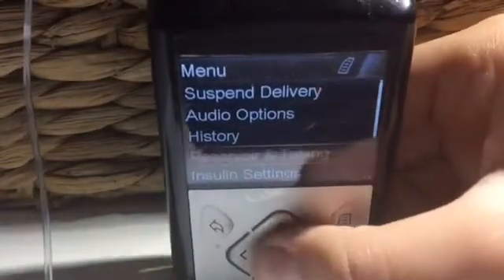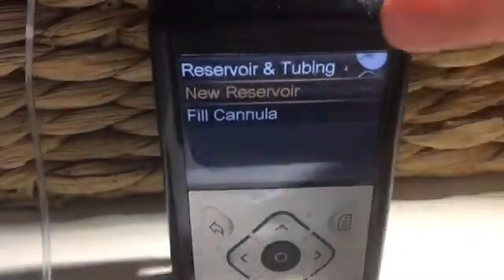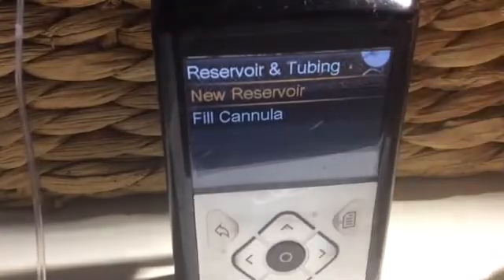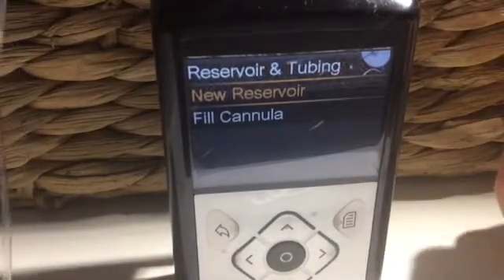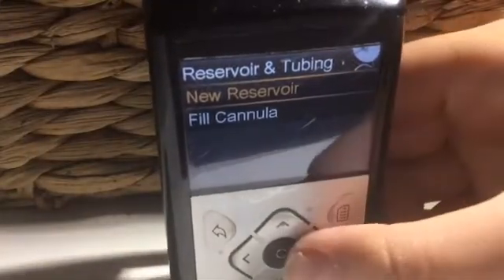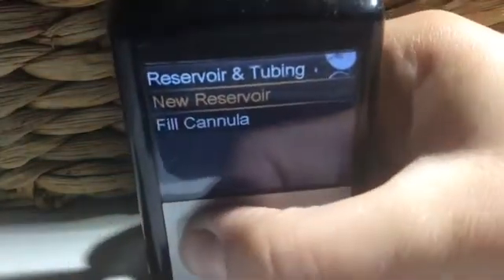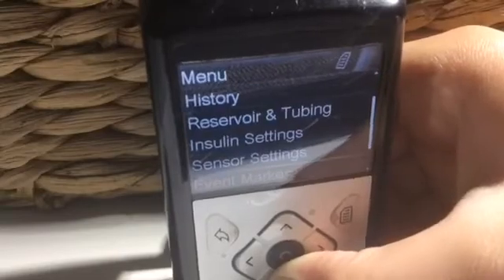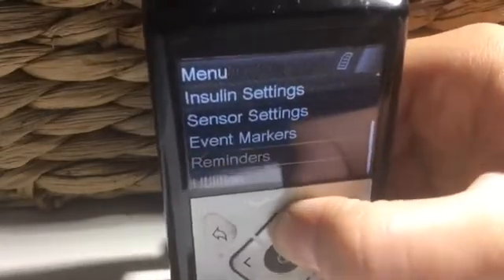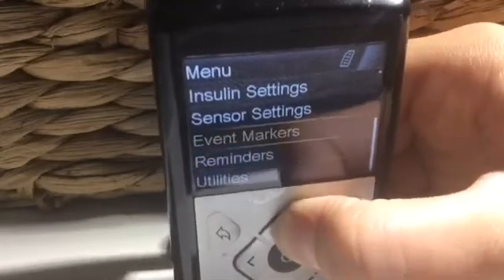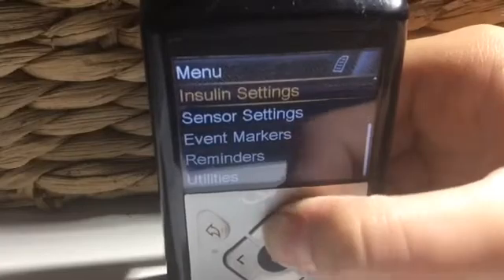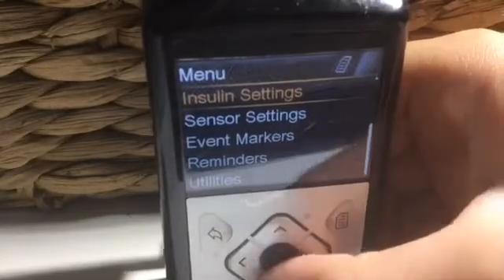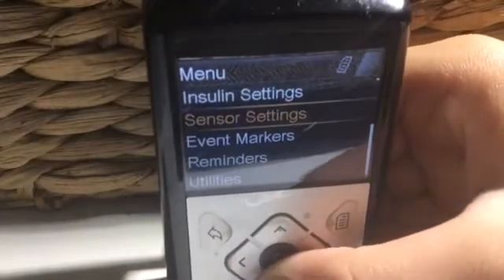Next is reservoir and tubing. Reservoir and tubing is when you change your insulin pump. For more information on how to do this, visit my set change video that clearly shows how to do this. Now, insulin settings — insulin settings help you to see all of your daily insulin dose and your basals too.